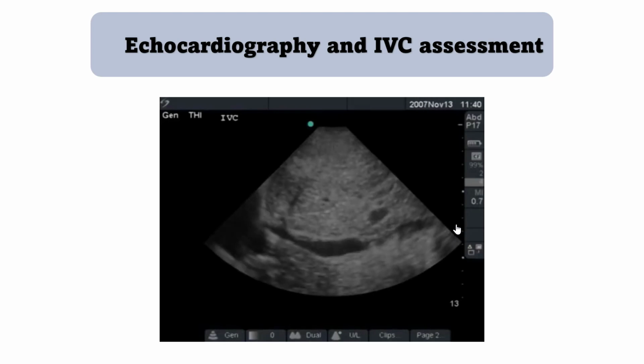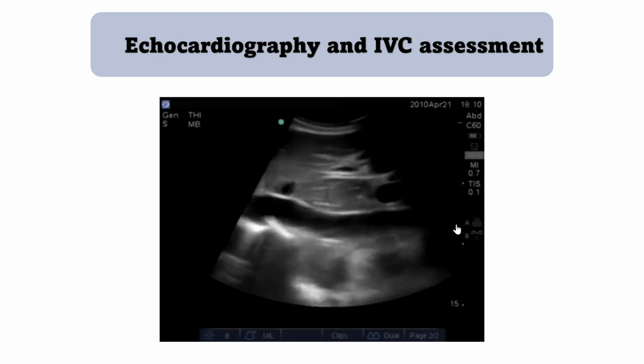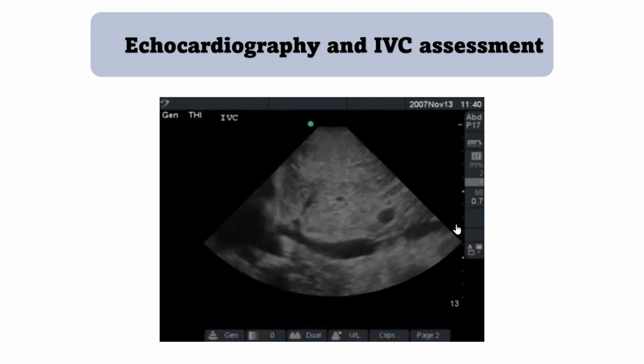The IVC assessment: you can see here the IVC, you can see a collapsible inferior vena cava, which indicates a hypovolemic patient. This is a non-collapsible IVC indicating fluid unresponsiveness.